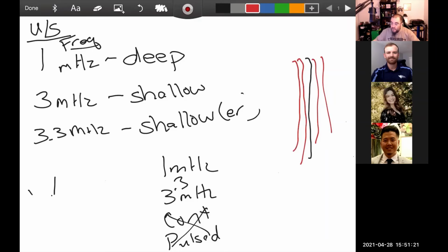But I've had students that have jumped over the spine, and I tell them, not a good idea to do that. They're like, well, I just quickly went over here. Number one, it's not a good idea because the ultrasound head lost contact for a small period of time. The other thing is you still kind of went over the spine, and not exactly the best idea. Well, I thought it was okay. No, it's not. Mr. McKeever says so.